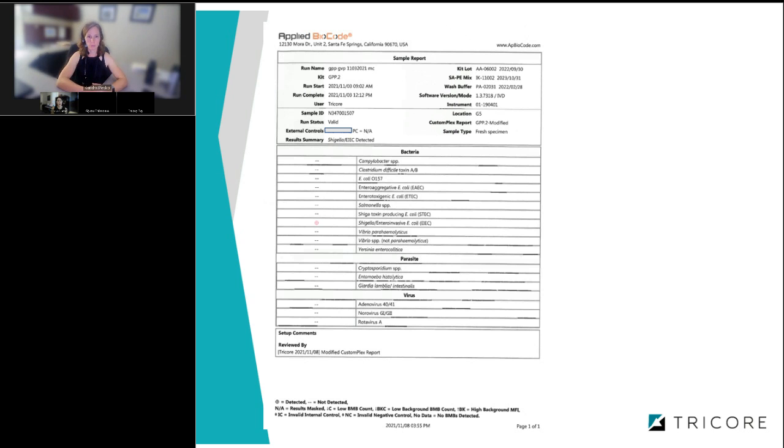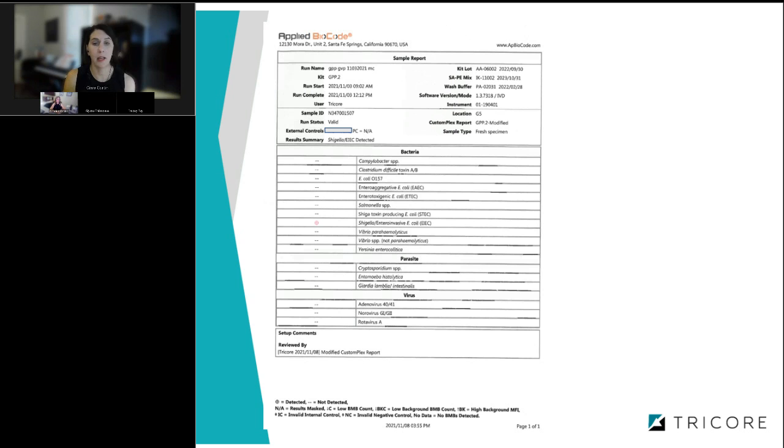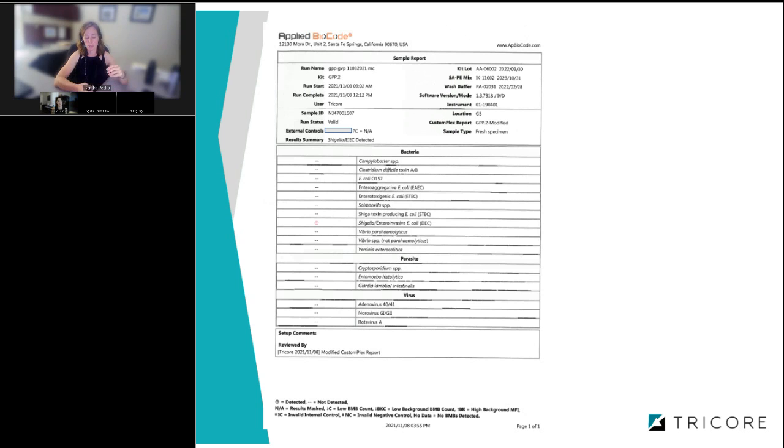When you performed culture on discordant results and you got a negative culture, you seemed to consider that sample a true negative. How did you take into consideration the possibility that the microorganisms could be inactivated or, quote unquote, dead? Sure, that's a very good comment. The microorganisms could be inactivated or killed, certainly by the time the culture took place.